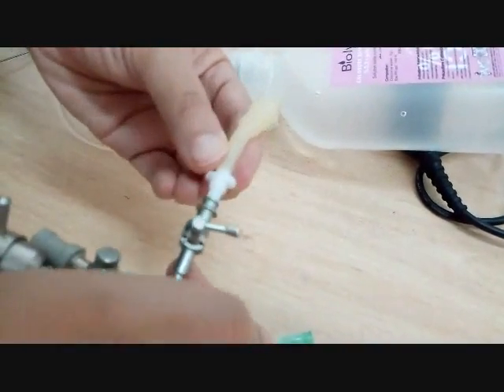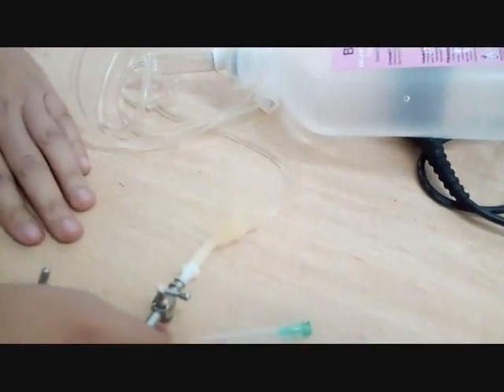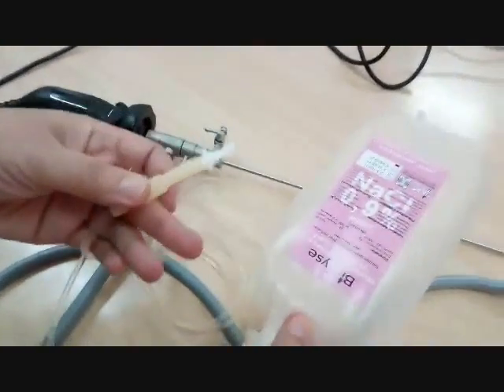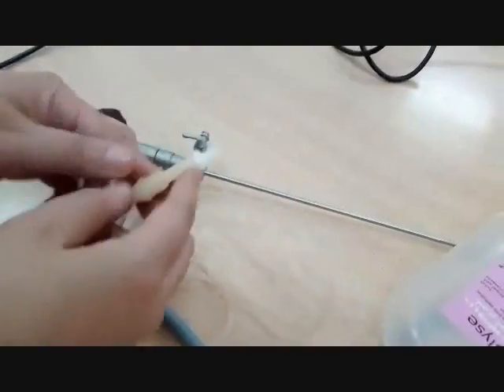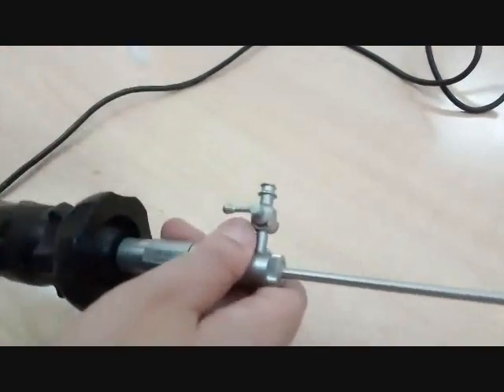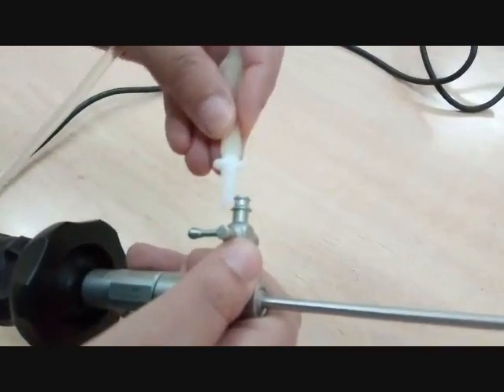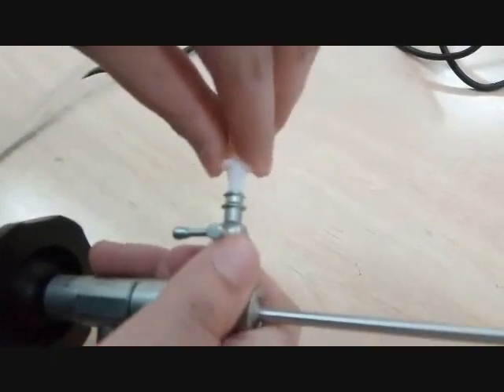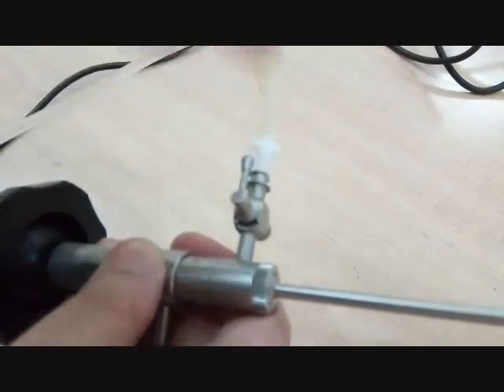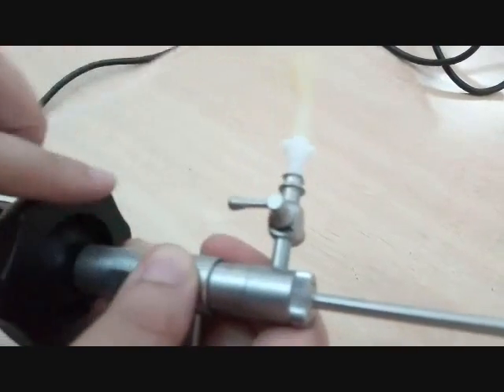We take the needle off and we plug like that. And again, a bag of normal saline, the administration set, we insert it inside the sheath's connector, like that. See that the stopcock here, it's closed. We open it, we close it again.